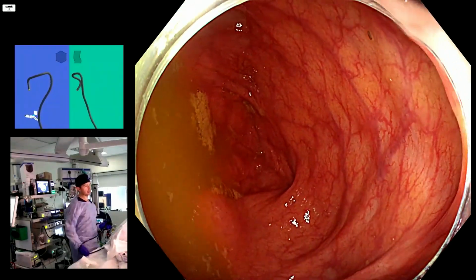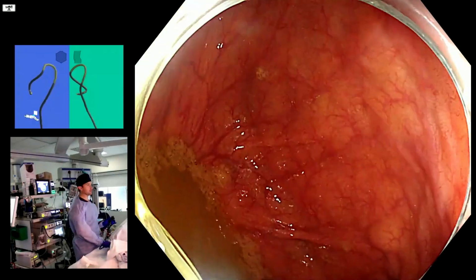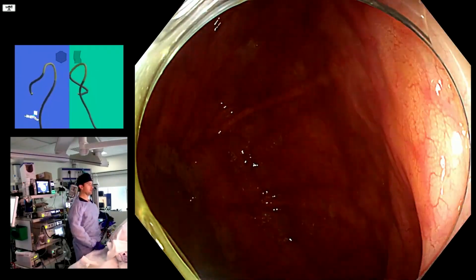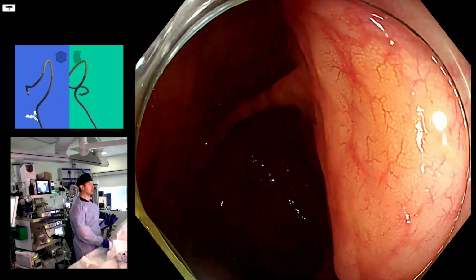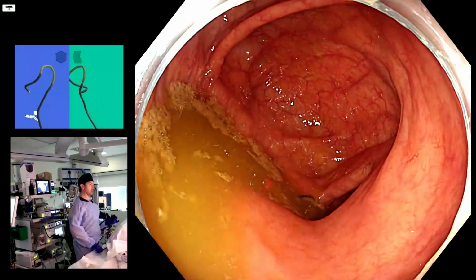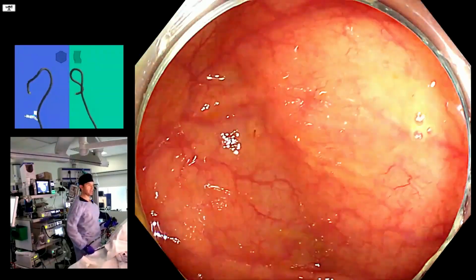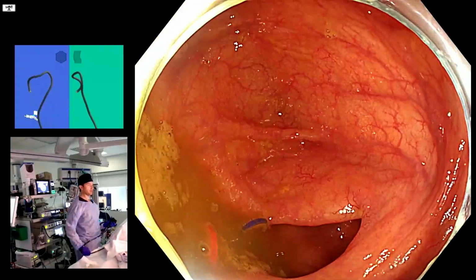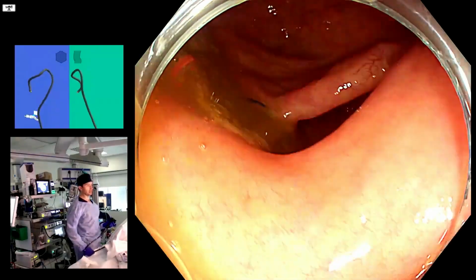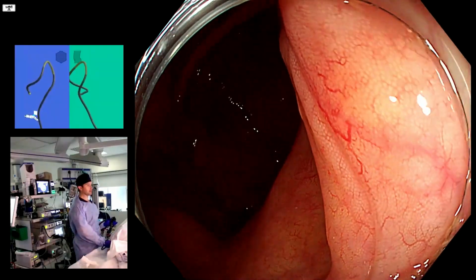So what is the solution to that? Well, one solution is, the patient is under anesthetic, just to push in the endoscope. So you can see what happens. I push in the endoscope more and more and more. The splenic flexure is really riding up. Maybe there's a chance of getting a splenic rupture by doing that. And also, given that the patient is not awake and cannot tell us that they're having pain. And also you see that we are really not progressing the tip. If anything, by doing this, we are moving the tip backwards.